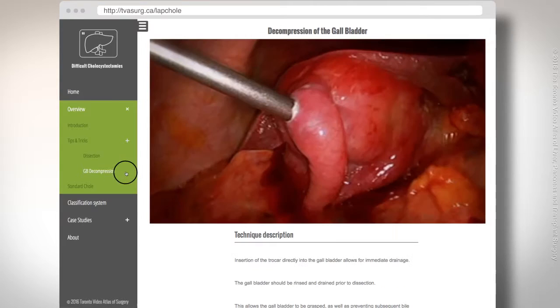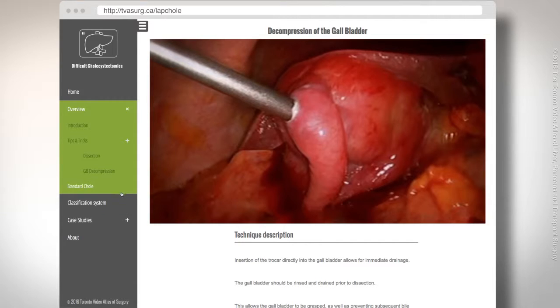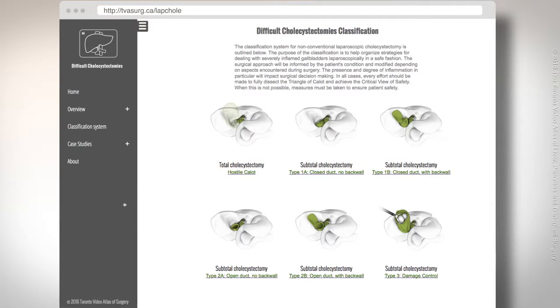We demonstrate additional tips and tricks regarding gallbladder decompression and other methods to facilitate exposure of the surgical field. We have subclassified difficult cholecystectomies into total cholecystectomy approaches and subtotal cholecystectomy.